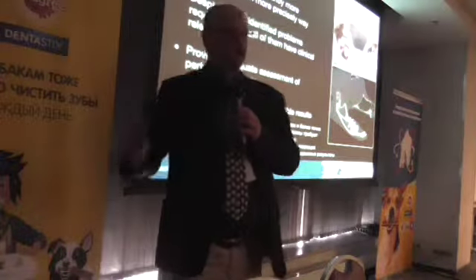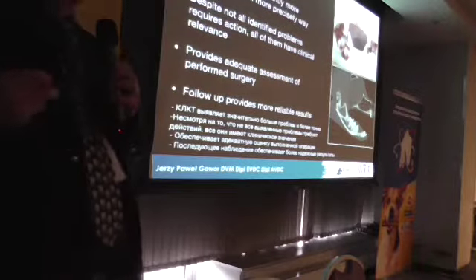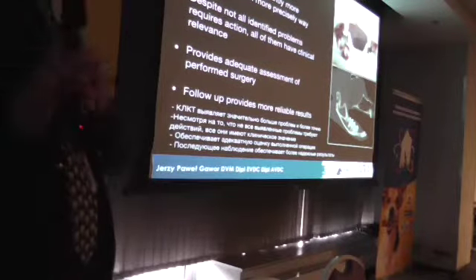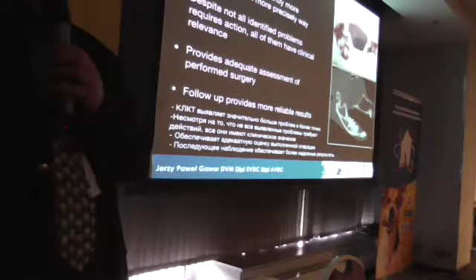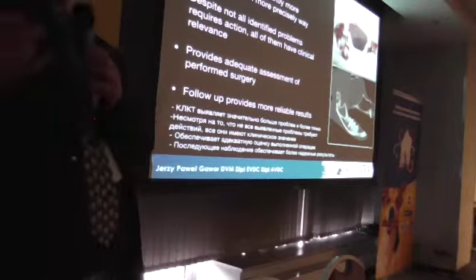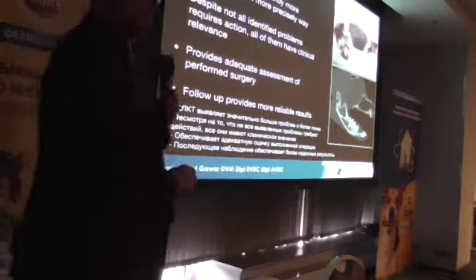I said that in three-dimensional imaging we can identify twice more pathologies, twice more problems. Not all of them are relevant, not all of them are super important, and they don't have to be operated on or addressed, but we have to know them.